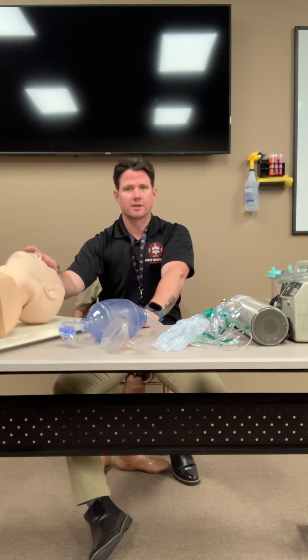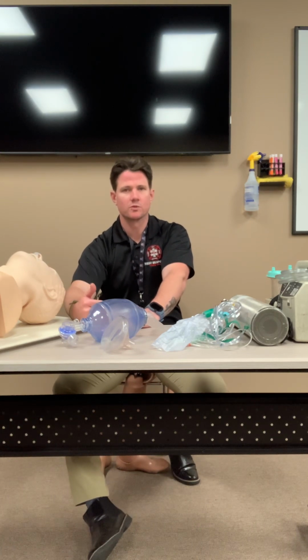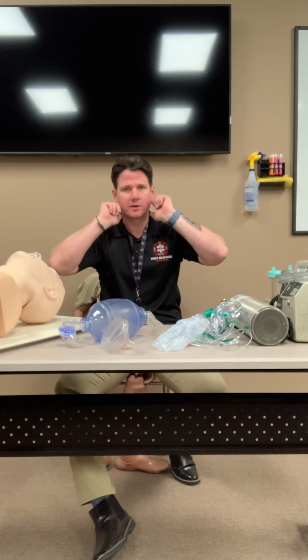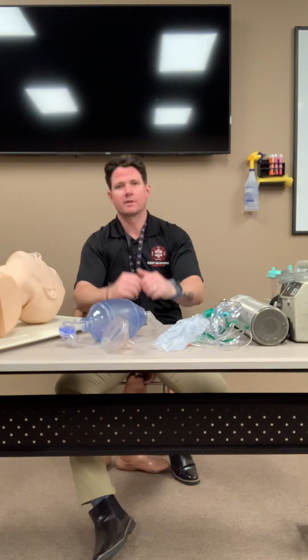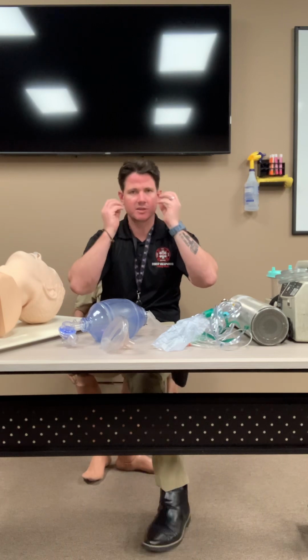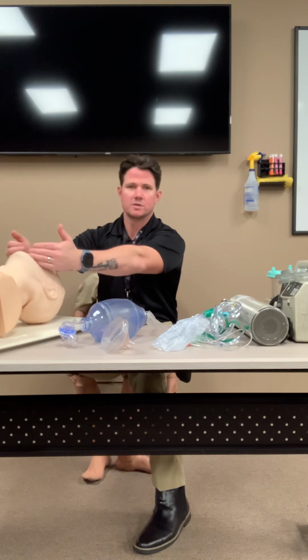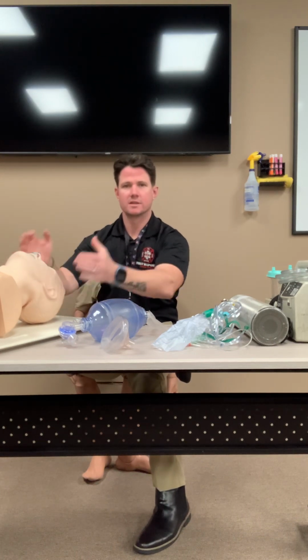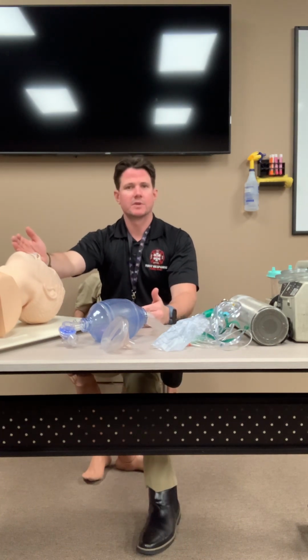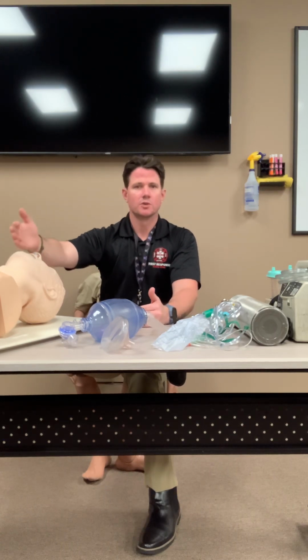Your contraindications are going to be head trauma where you're suspecting some sort of basilar skull fracture. That's a key term, right? Basilar skull fracture, right? Anytime you see bruising behind the ears, right? Two black eyes are called raccoon eyes. The bruising behind the ears is called Battle's sign. Anytime you see Battle's sign or raccoon eyes, and/or you have fluid coming from the ears, the nose, and/or the mouth, those are all signs of a basilar skull fracture where you would not want to use the NPA. Okay, otherwise you can use an NPA, you can use an OPA, you can use them both.